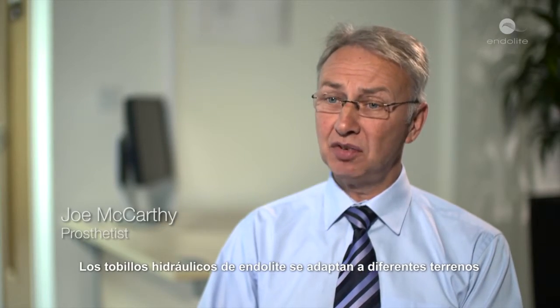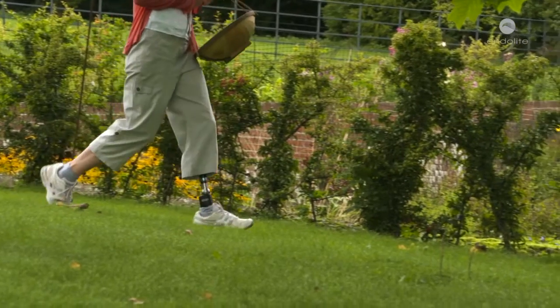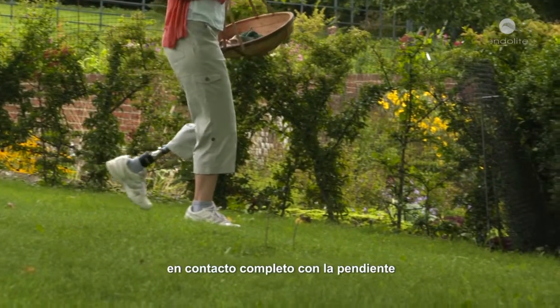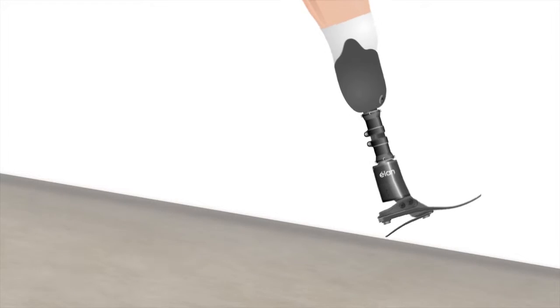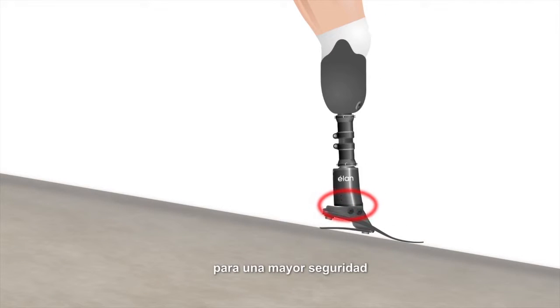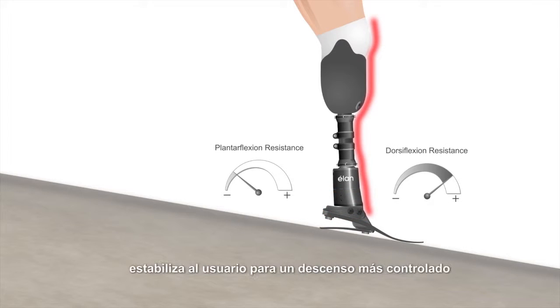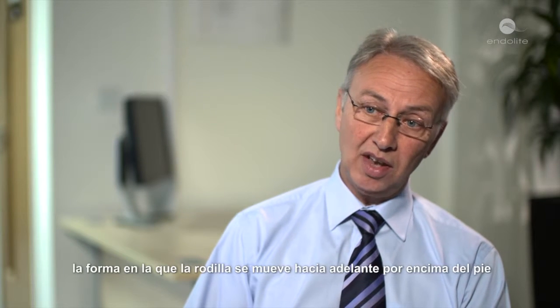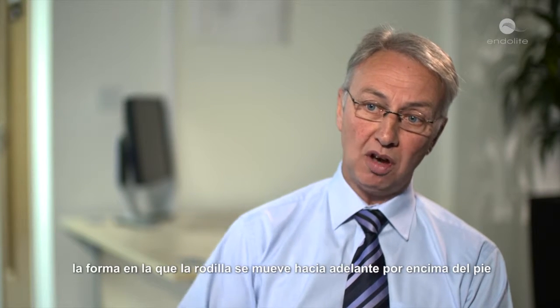Enderlite hydraulic ankles adapt to different terrain on the first step. When walking downhill, the heel softens, allowing the foot to fully contact the slope sooner for improved safety and security. At the same time, an increased braking effect stabilises the user for a more controlled descent, and it does that by controlling the tibial progression — the way the knee moves forward over the foot.